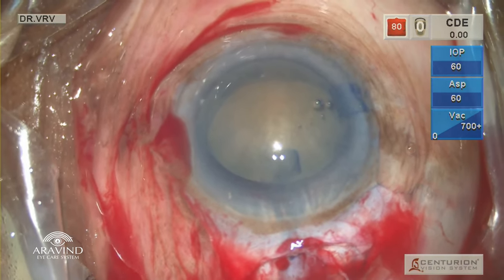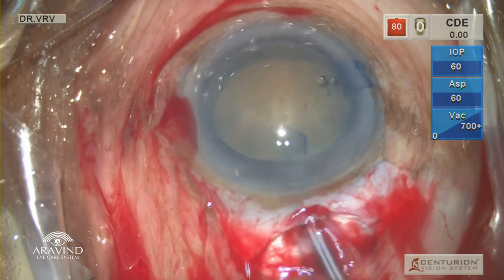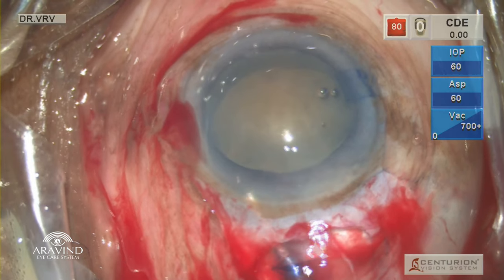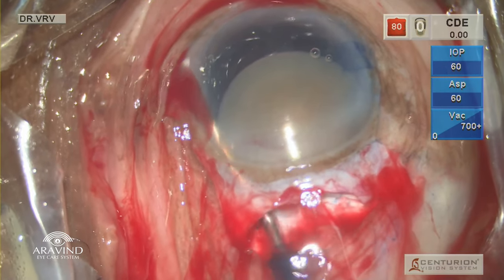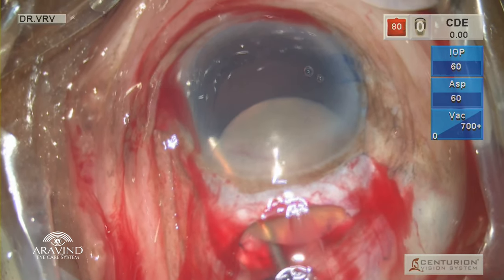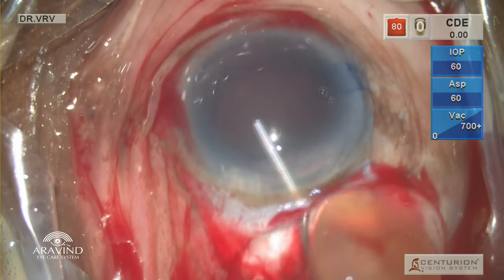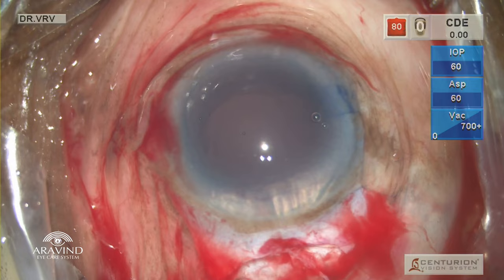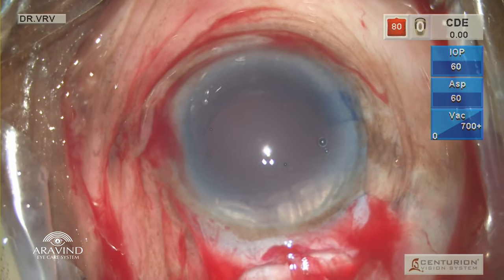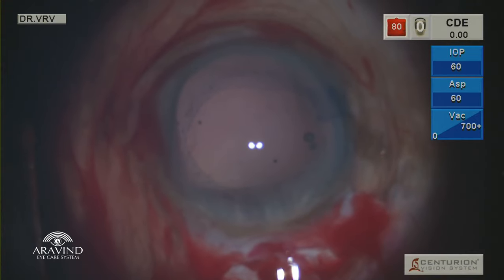So the best way to remove a nucleus in Morgagnian cataracts is to shallow the anterior chamber. When you shallow the anterior chamber, the bag also shallows. Once the bag shallows, the nucleus pops into the anterior chamber. Then you can inject viscoelastic and use a vectis, or like in this case, I had a larger tunnel, so I did a visco expression by keeping the visco cannula at one end of the tunnel and depressing the lower lip. So viscoelastic is again injected into the anterior chamber and IOL placement is being planned.